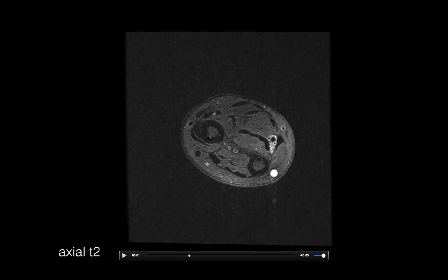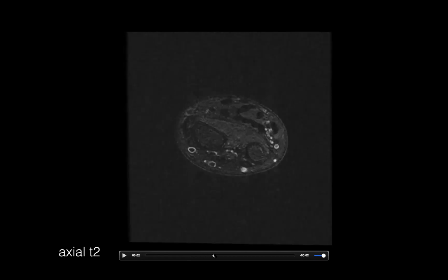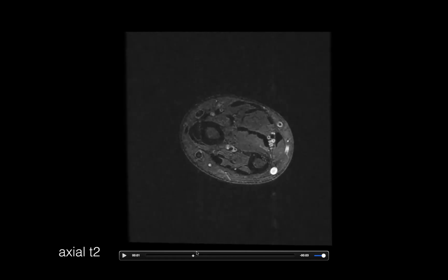In that time between the 90 and the refocusing pulses, the blood leaves that slice, but never gets refocused, right? And so that's why you see this sort of black blood there. So here, this must be slow enough flow, but still pulsatile. Yeah, exactly. So it's kind of slow flow that's pulsatile here that produces this look.